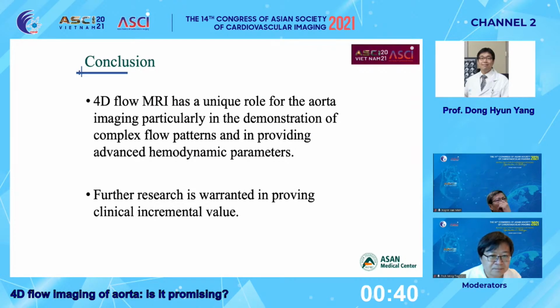Ladies and gentlemen, this is my conclusion. 4D flow MRI has excellent potential, but many limitations still exist. So, further studies are needed to prove the clinical added value of 4D flow MRI.